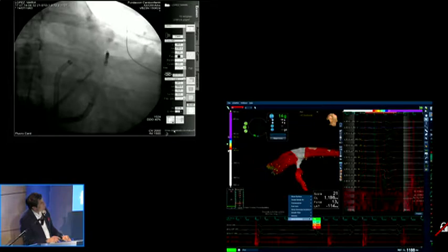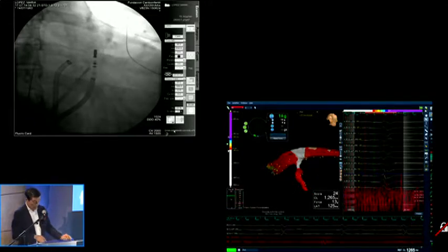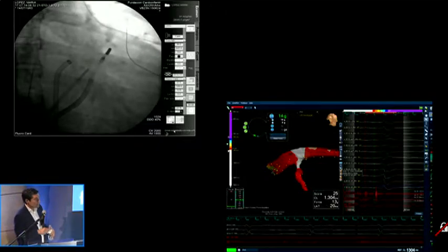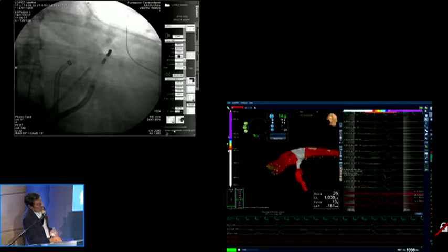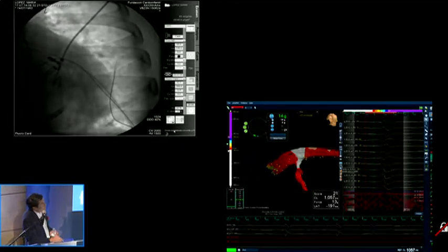In view of the anatomic difficulty to advance the irrigated catheter to that area, and assure success, why not a left ventricular endocardial lesion in the earliest portion of the wire? Fermin, could you answer? Which would be the criteria that would suggest that it could be effective to go from the endo?